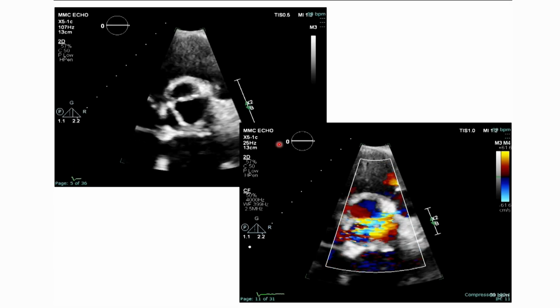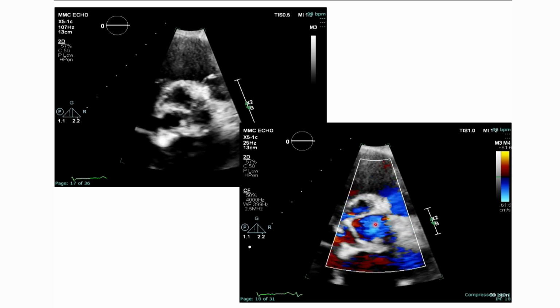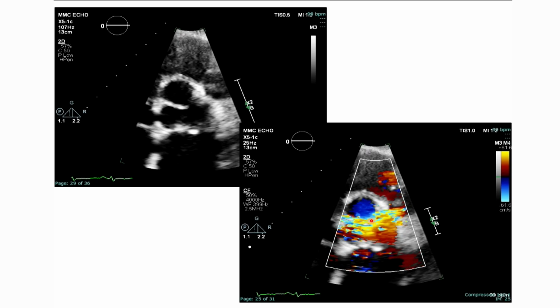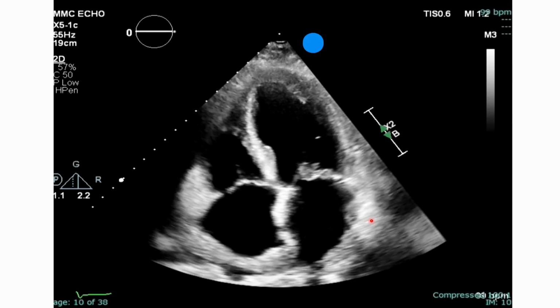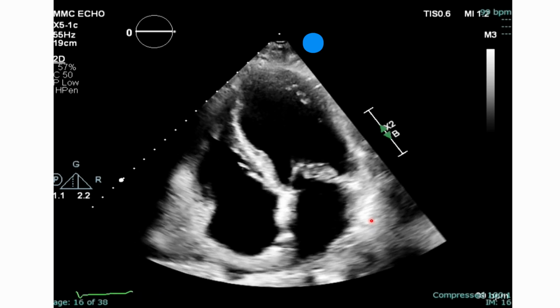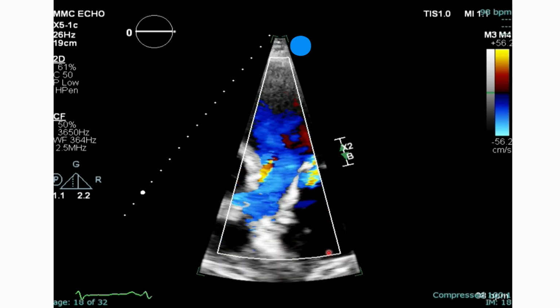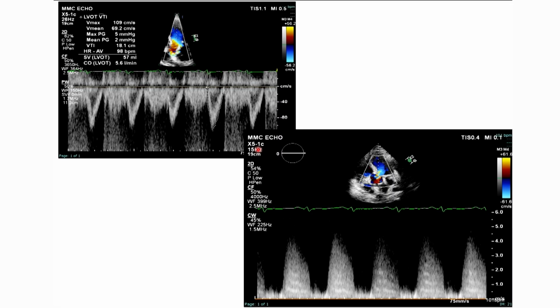We put color on here, and you can just see that whole coaptation is just full. This is just this regurgitation bleeding over through. But that is a lot of aortic regurgitation. Here we have our, now that EF doesn't look quite normal, right? Look at all that regurgitation coming in through here. We want to throw some Doppler through there.